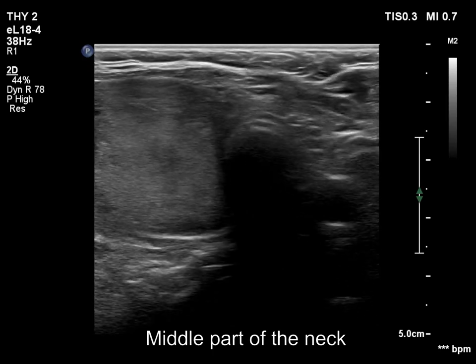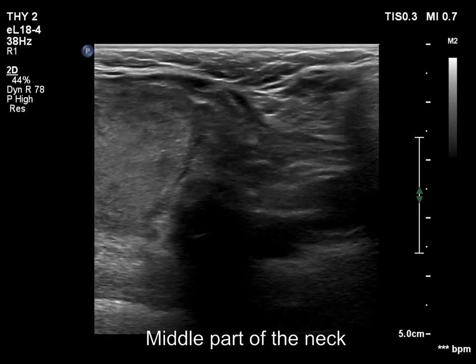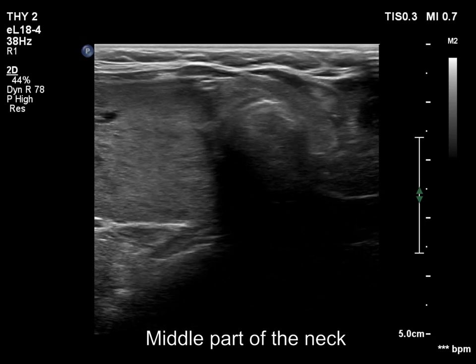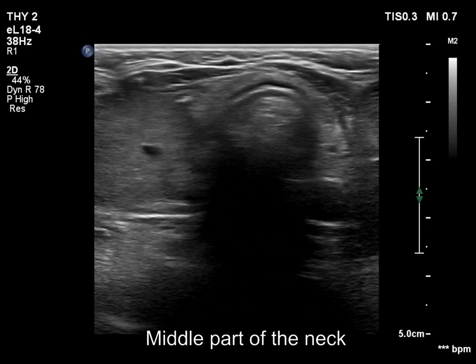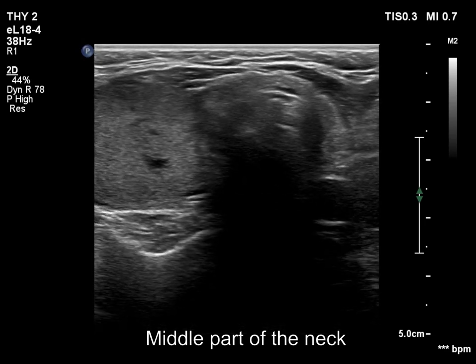Now we check the diameter of the trachea, now at a lower level, and now at the level of the upper third of the thyroid.